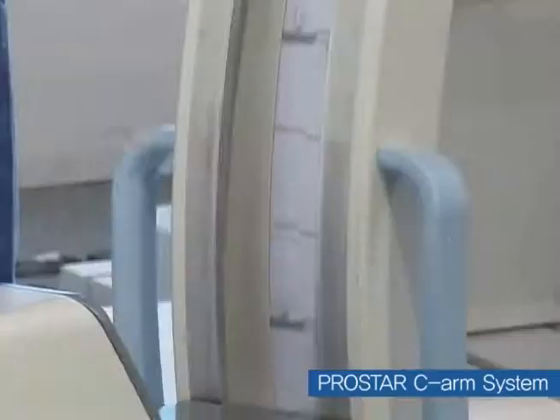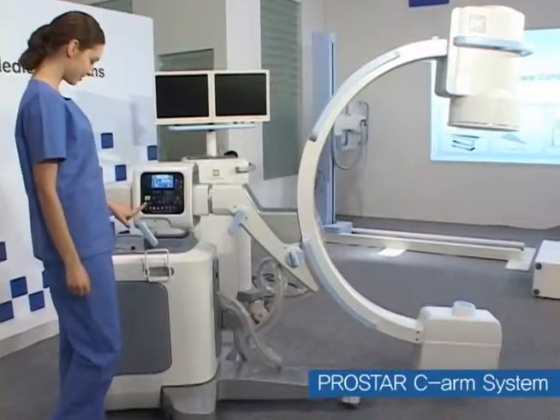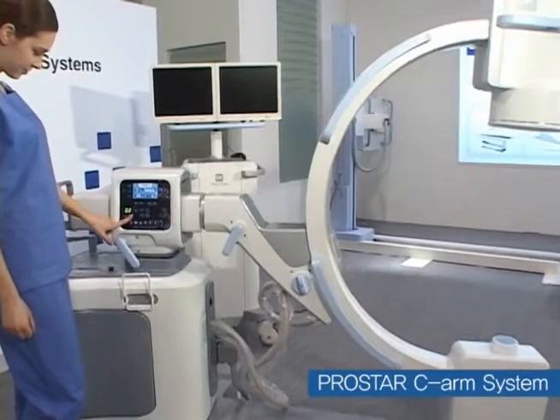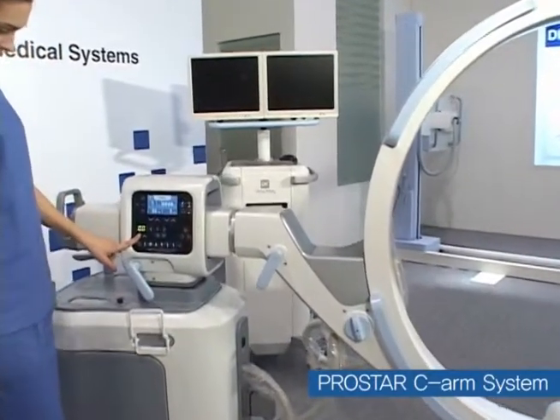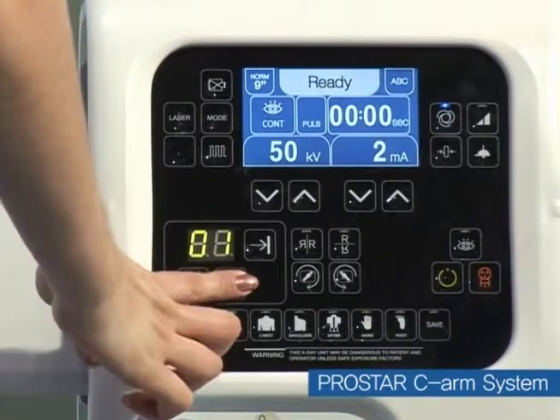A membrane switch is installed on both sides of the equipment operation part, in which users can check operation information and various data from either side of the equipment, so that users can operate it conveniently.